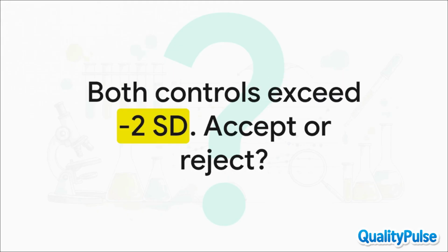Now for scenario 2. You test 2 different control levels in the same run. Level 1 is at minus 2.2 SD, and level 2 is at minus 2.4 SD. Accept or reject. Look really closely at the pattern. We have 2 consecutive QC results in the same run, and both are greater than 2 SD on the negative side of the mean. That is a glaring violation of the 2-2S rule across your controls. It indicates a systematic error affecting your whole analytical curve, so you must reject the run. Absolutely no patient results can go out.